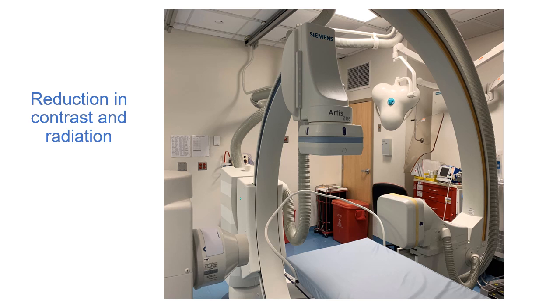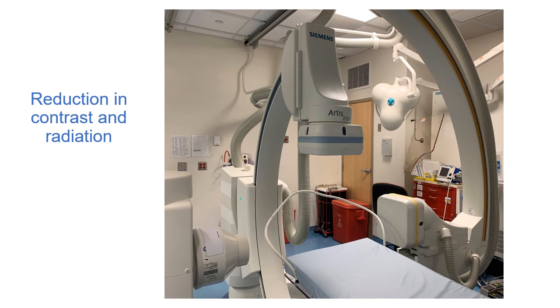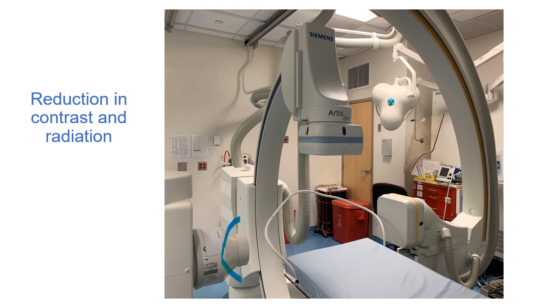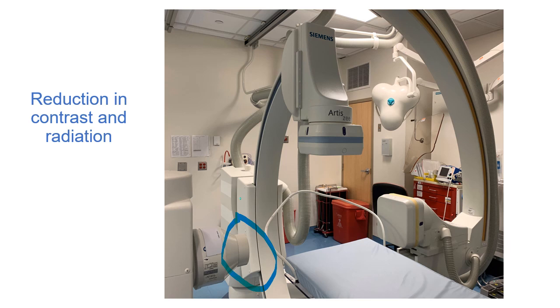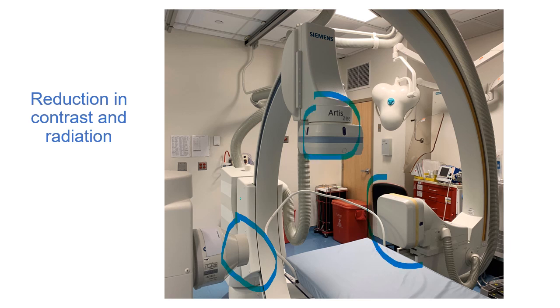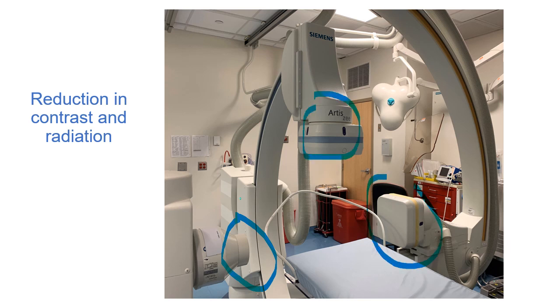Biplane coronary angiography depends on using two radiation sources and two image intensifiers, so we can save contrast and radiation.